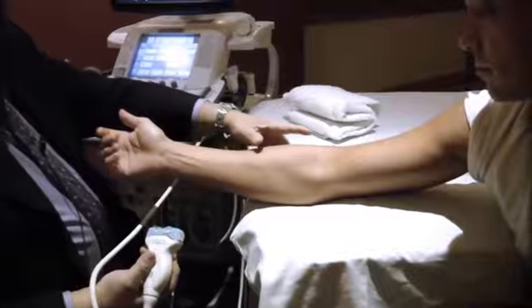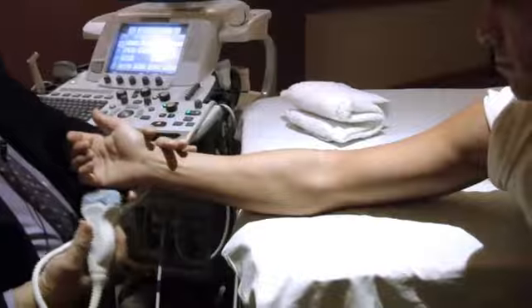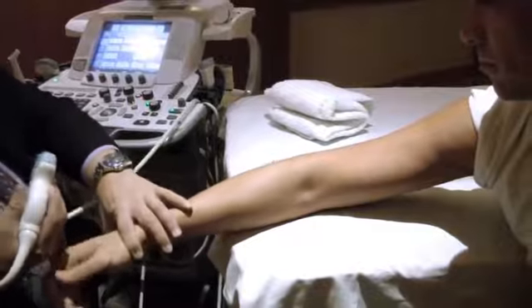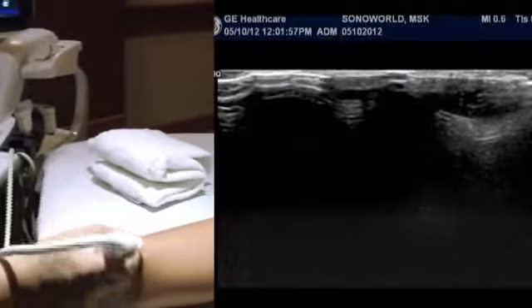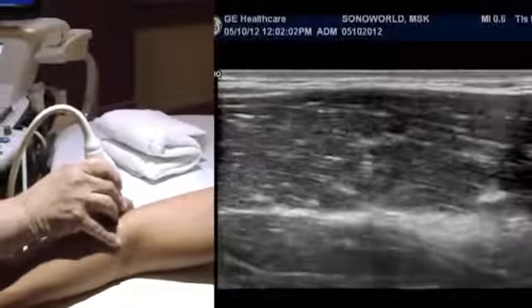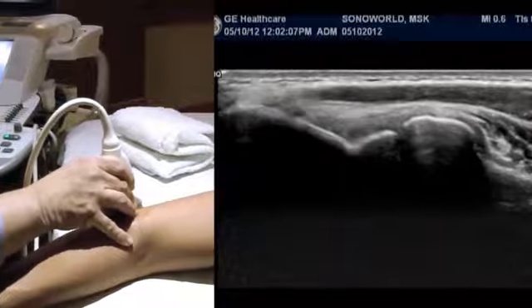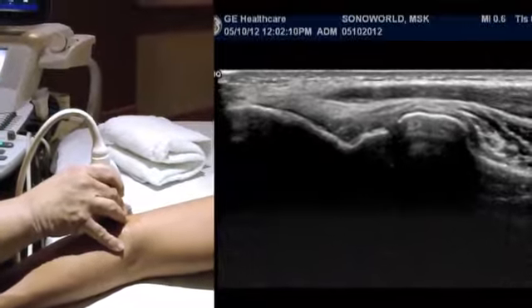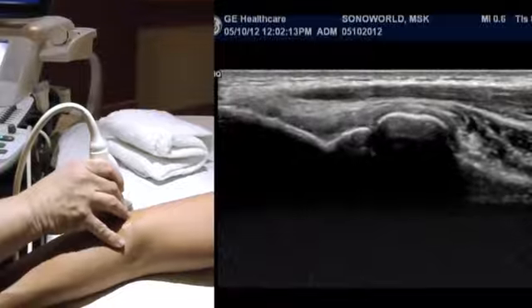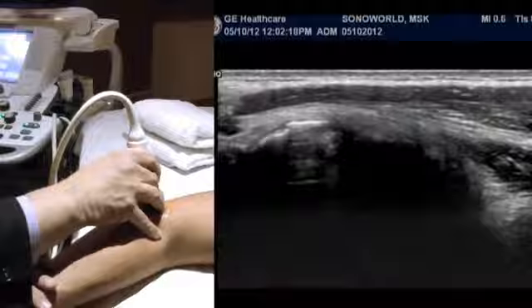within the cubital tunnel. The third of a four-quadrant examination of the elbow will be the exploration of the radial collateral ligament. We're going to put the patient in pronation and identify the radial ligament by going to the posterolateral corner of the elbow. And once you have identified the common extensor tendon origin of the patient, identify the posterolateral corner of the radial head. We're going to put the elbow in 30-degree flexion.